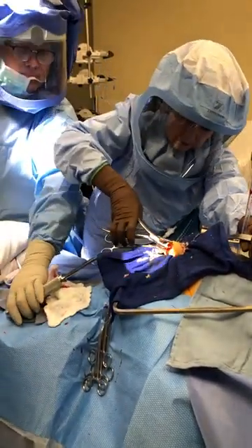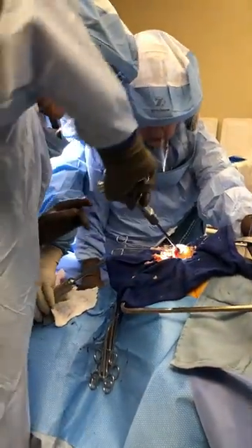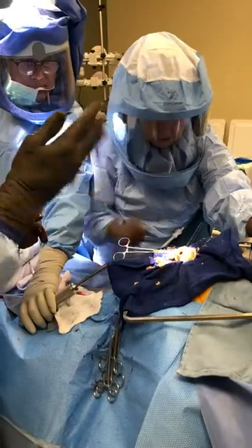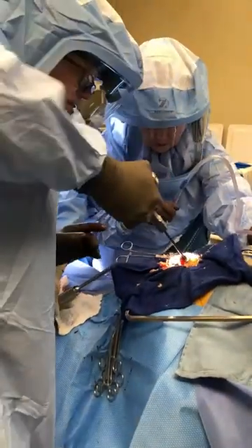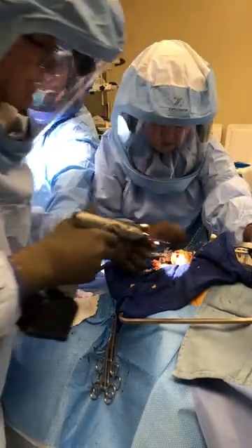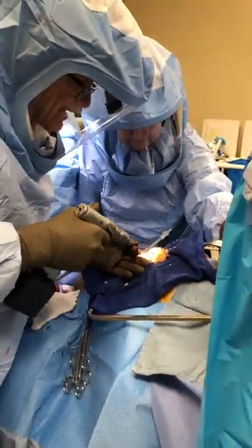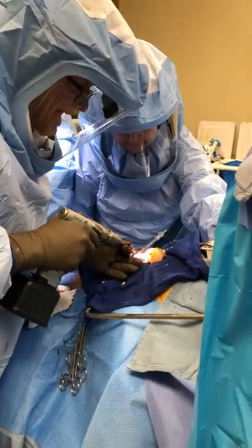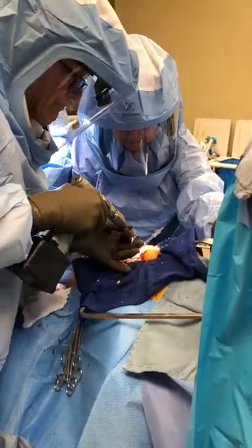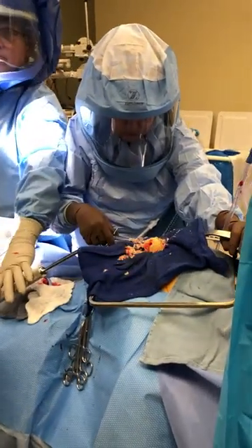Now we'll take it off. We rounded it a little bit with this tool because the stem has little rounding into the cap. I think the apex of the head is marginally vascularized at this point, so I'll make a few drill holes around the apex, only about half to one centimeter in, for revascularization.